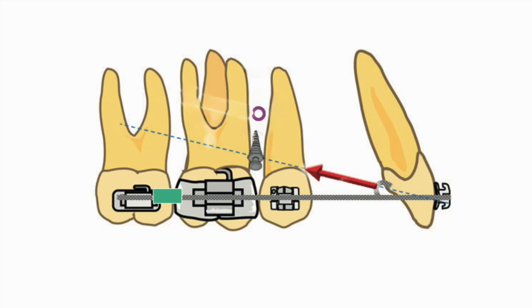How does the force system operate in the active unit? Because the active unit is the total arch, the center of resistance moves distal to tooth number 5, and we can also see the line of action of the force has a distance from the CR, so the force system goes like this. So we have the force and also a clockwise moment. With this kind of force system, the total arch will move distally and also rotate clockwise.